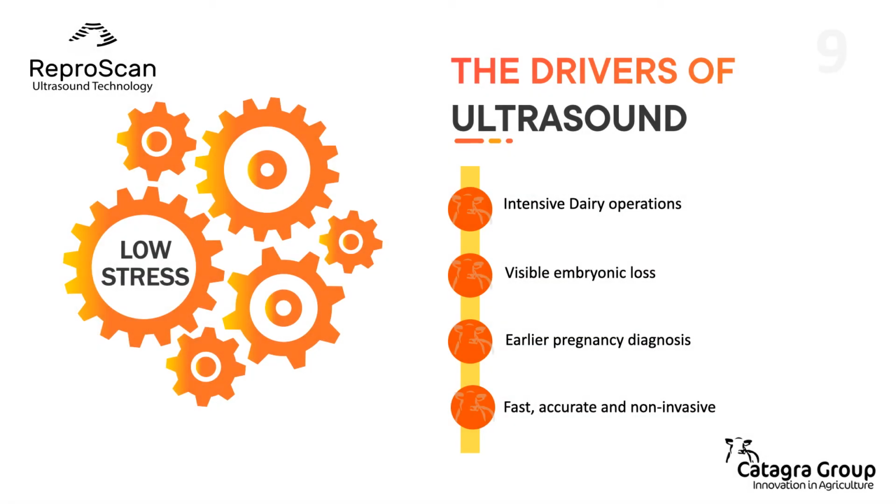The early drivers of ultrasound come from intensive dairy operations. With cows seen individually twice a day while milking, visible embryonic loss was all too common after manual palpation. With the ability to measure milk production on a daily basis, it was easy to apply a dollar value to lost production due to stress placed on the herd.